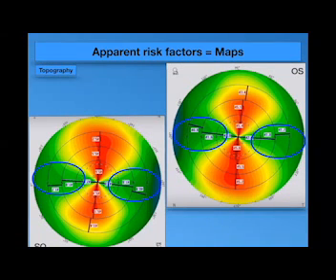About myself, I don't believe that there is what's called superior keratoconus, because the ectasia process, the weakening of the cornea, goes to the inferior part of the cornea, not the superior. The pathological process of ectasia goes to the inferior cornea, away from gravity. But the main point is the eyelid dropping the superior cornea down to the lower cornea.